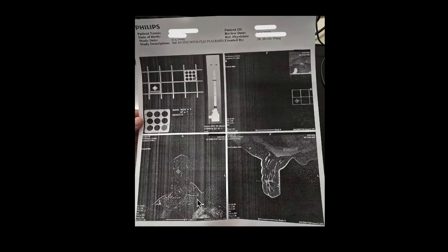This is your target. This is what it would look like, but the main thing I'm looking at is here on the top left. It is telling me where the fiducial is. It is telling me where I should put this block, and within that block, which of the 9 holes I should be putting my needle in, which would be this one. And this is the depth, which is 7 millimeters. And it's even telling me, because my target is somewhere here at 2 o'clock, if I wanted to, I can aim at 2 o'clock to really target the target.